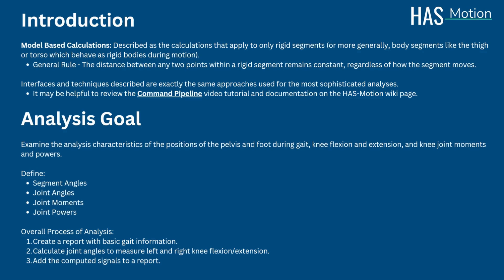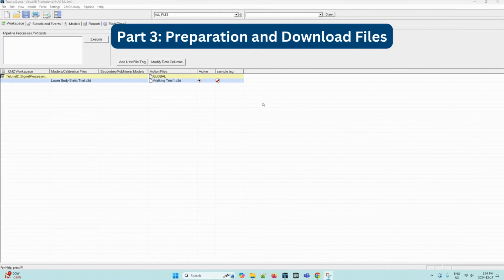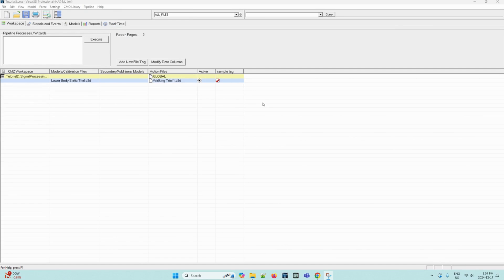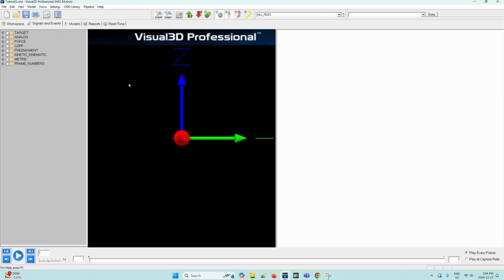First, make sure to have downloaded the tutorial3.cmz file from the tutorial wiki page. I have this loaded into the Visual 3D Application Workspace already as seen. You can load this in as well by selecting the open file icon on the toolbar here. Once loaded in, we can navigate to the Signal and Event Processing tab to visualize an animation of the model based on the movement data and the model that was applied to it.